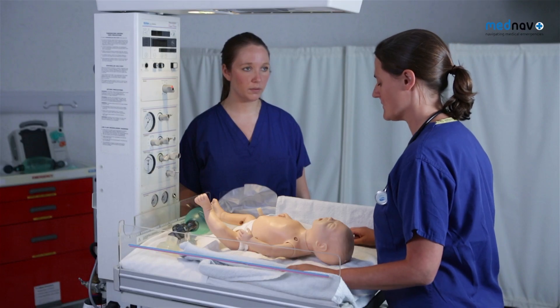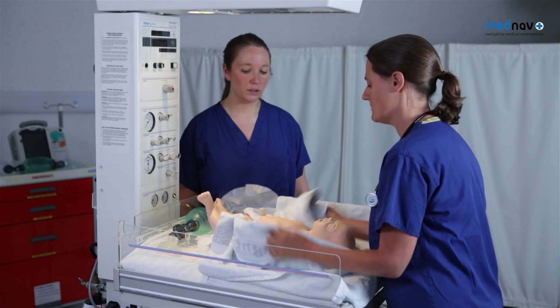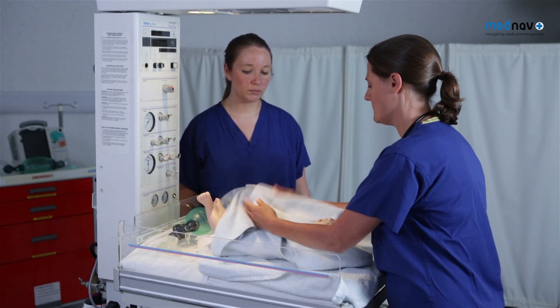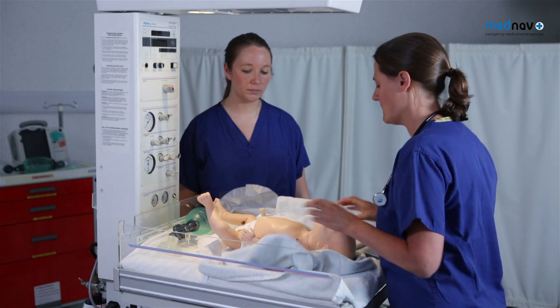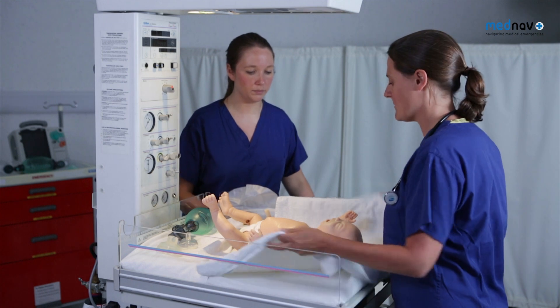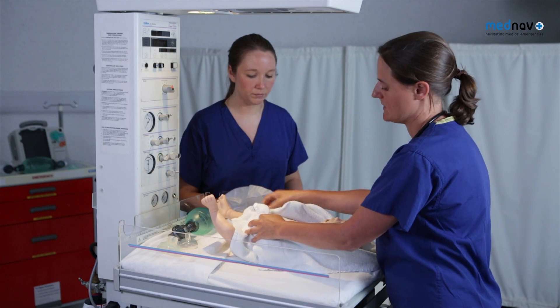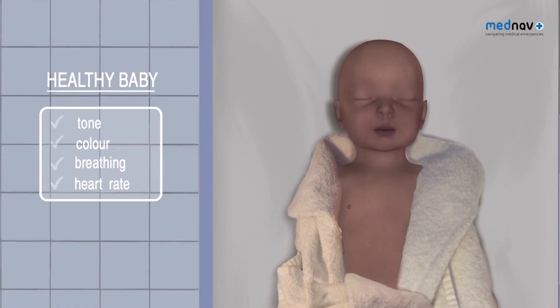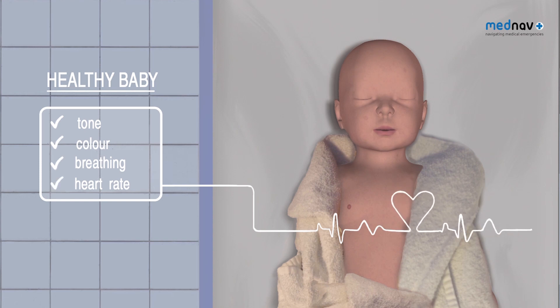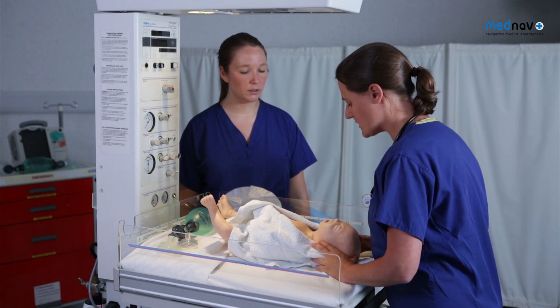Receive the baby and start a clock. Dry the baby and stimulate it with a towel. Try and stimulate the baby for 30 seconds, removing the wet towel. Wrap the baby to keep it warm and make sure you can see the chest to assess tone, colour, breathing and heart rate. If there is a meconium blockage present, then you can suction it.